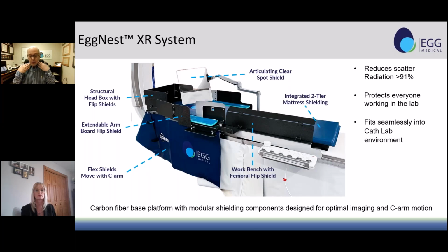The neck's a great radiation shield. It's very thick. And so you're getting some off the shoulders and the body, but a lot of it is just coming directly up from the bottom. And we're able to shield that and reduce the head dose by about 80% or so. Next slide, please.